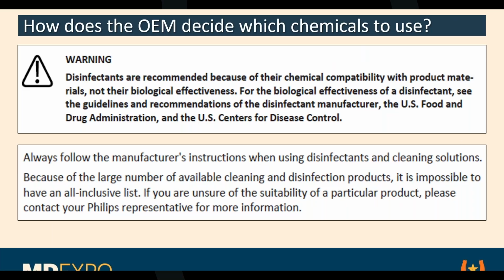During COVID, some of you know this, probably all of you felt it at one level or another, there were a lot of layoffs of workers in hospitals, and a lot of them came from central cleaning. The thinking was, oh, well, we're not going to be doing any procedures, we don't need to have instruments cleaned. So they laid off a bunch of cleaning people in central processing.